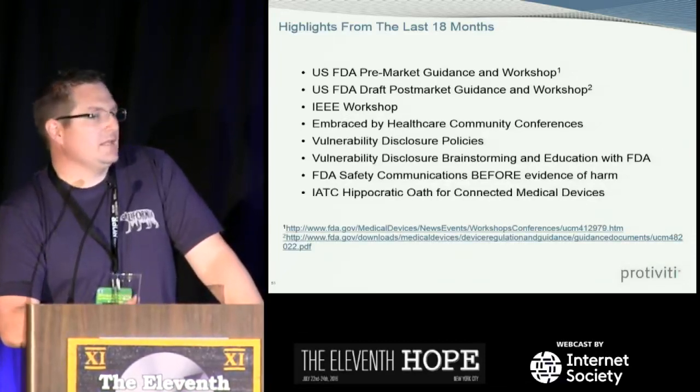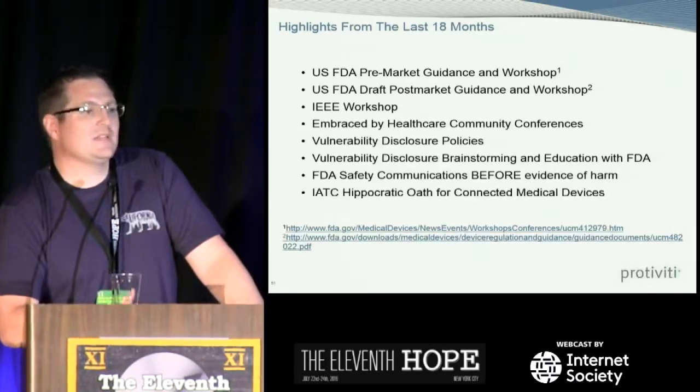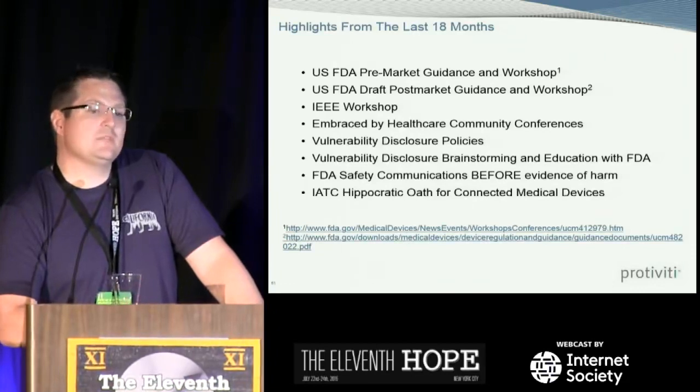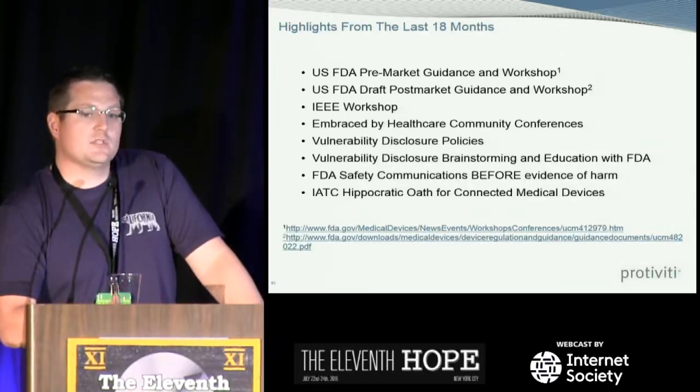The FDA actually issued a safety communication, and this was with Hospira pumps. It was a result of Billy Rios' research on the infusion pumps. But they actually issued a safety communication that said, hospitals, look at these systems. They're vulnerable. We recommend you pull them out of service. That was precedent setting. That happened before evidence of harm. If you follow the FDA, recalls, things like that, typically don't happen until there's recorded loss of life or adverse events reported to the FDA. So that was precedent setting. They stood up and they said, hey, we're issuing the safety communication.